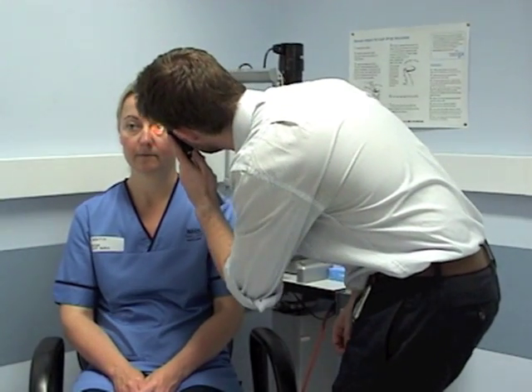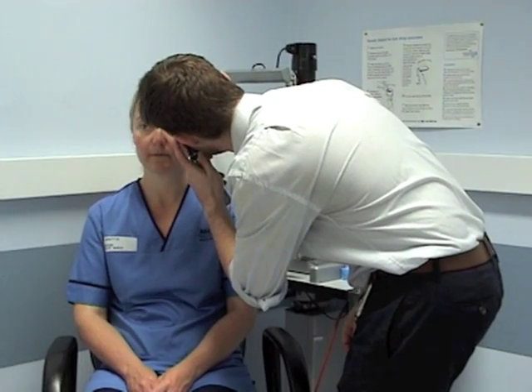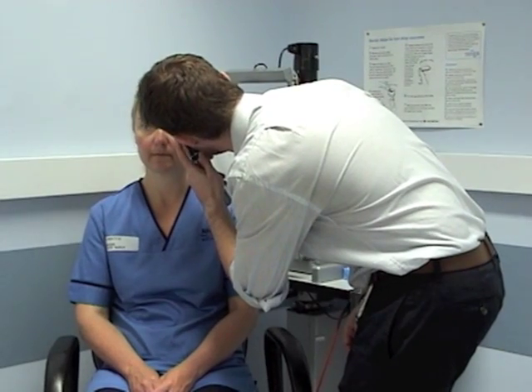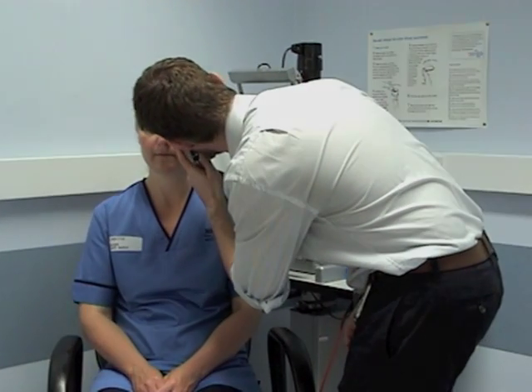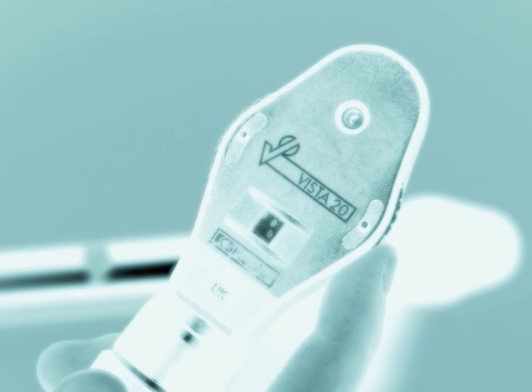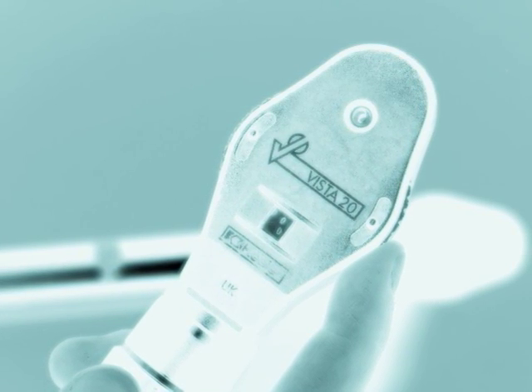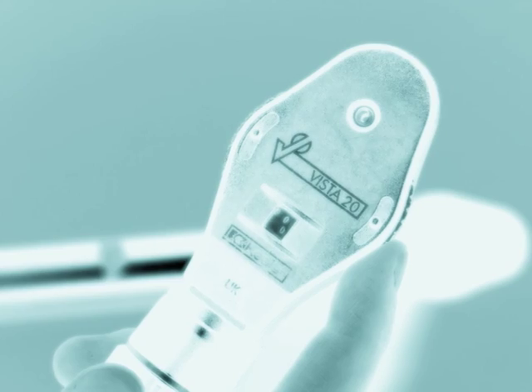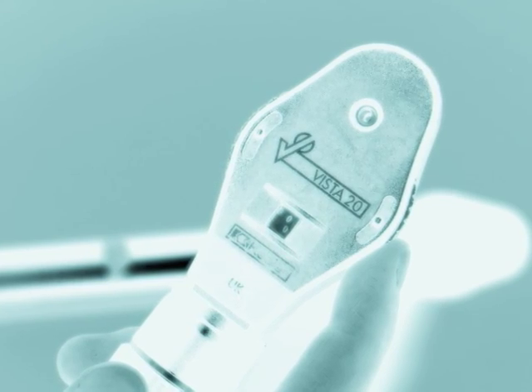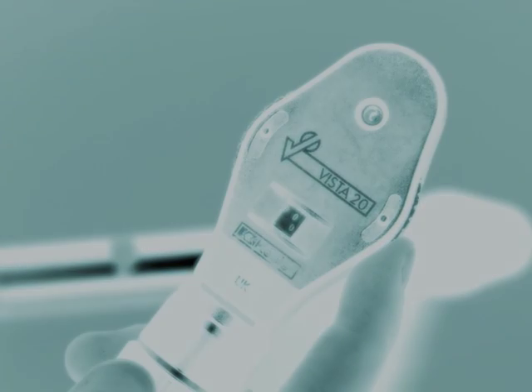Don't forget to use your left hand and left eye when examining the patient's left eye. Using the direct ophthalmoscope can be challenging at first; however, with practice, it can become an essential diagnostic tool for ophthalmologists, physicians, and general practitioners.